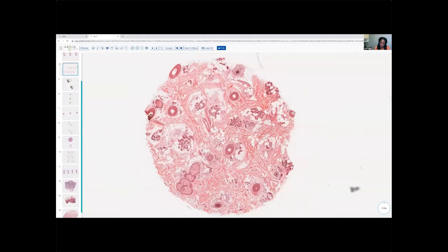And so those hairs are going to be smaller caliber, smaller hairs, etc. And so there's going to be some portion of that anyway. But in the bulbar and suprabulbar zone, that shouldn't be happening. We should not have these small hairs. So this is clearly miniaturization. And again, miniaturization is a salient feature of androgenetic alopecia. Okay, so we got our miniaturization, we got our fibrous streamers.